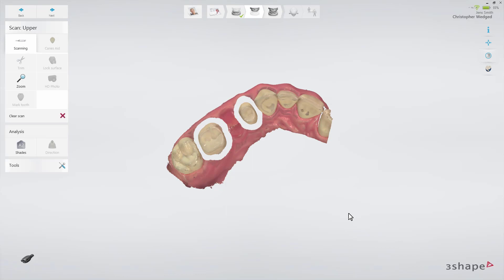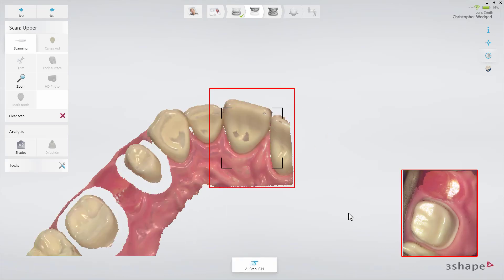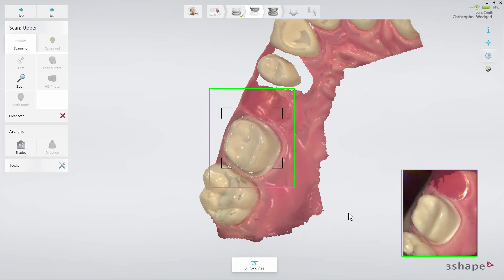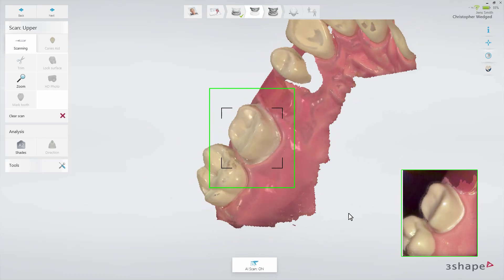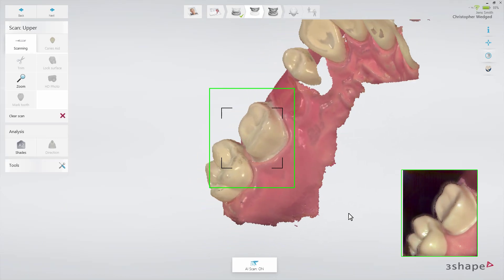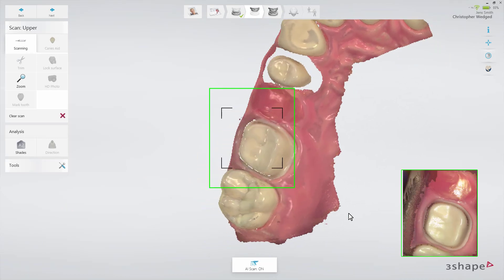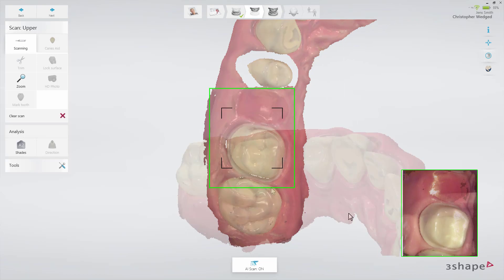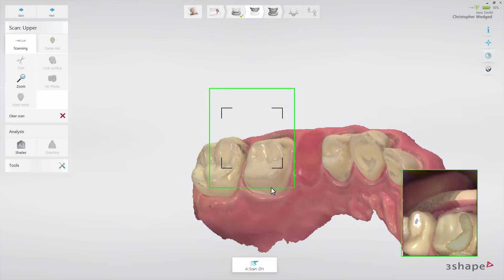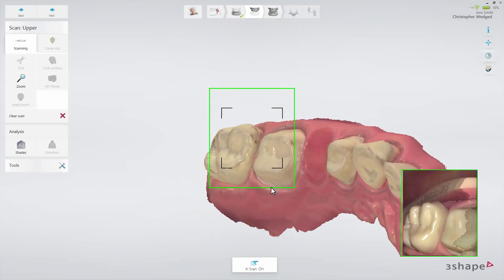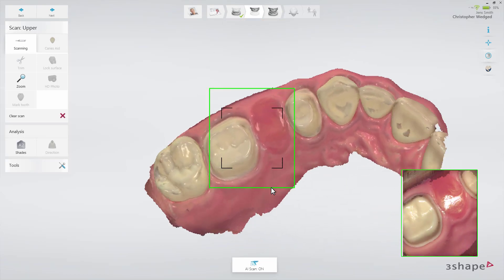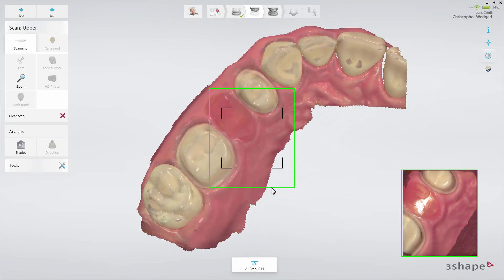Remove the retracted cord, dry the teeth, and scan the margin immediately, before the gingiva collapses. No matter which method you prefer, make sure that you cover the prepped area entirely, including the margin line and contact points.